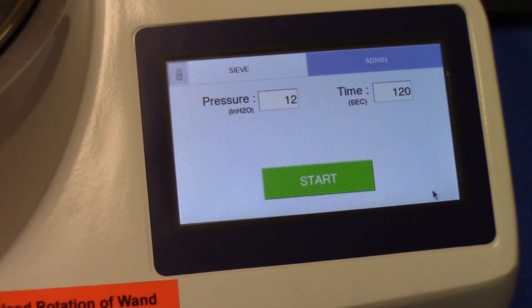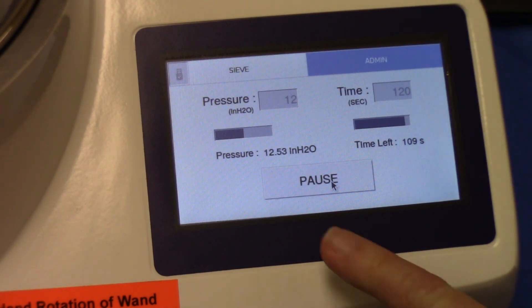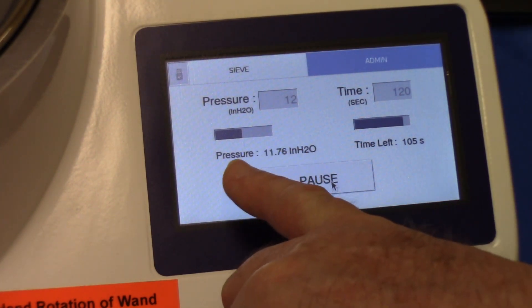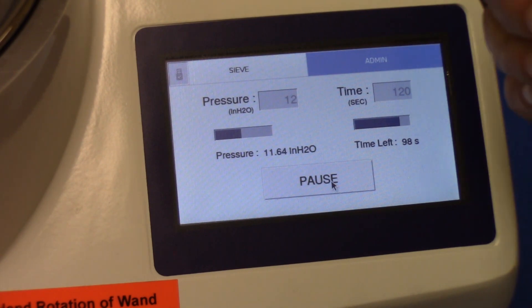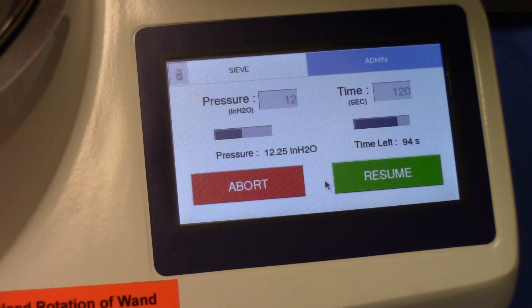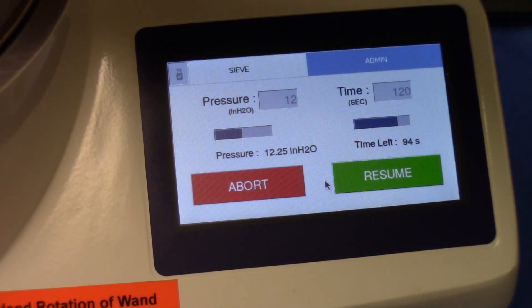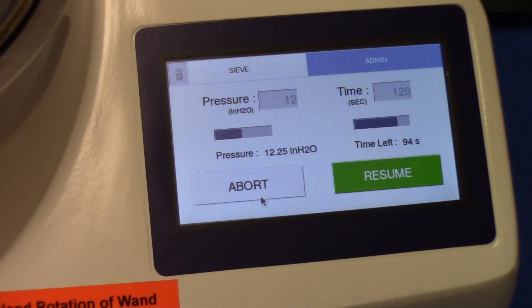Once those parameters are set, press start. The vacuum begins automatically, and the wand begins to rotate after the vacuum pressure reaches a minimum of 2 inches of water. Notice how the display stabilizes plus or minus 1 inch within the 12 inches and the time is decreasing. If the machine must be stopped, press the pause button, at which time you can clean off the cover should any material become adhered to it, then put it back in place.